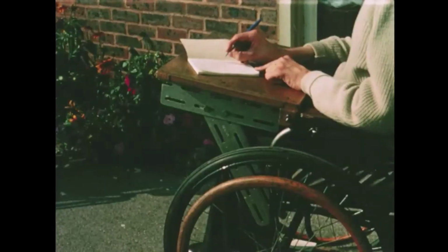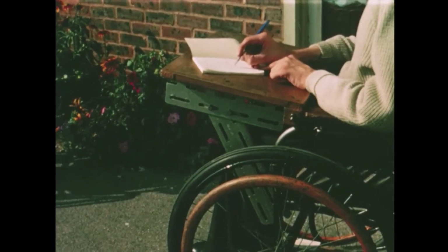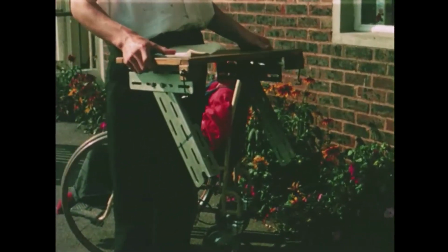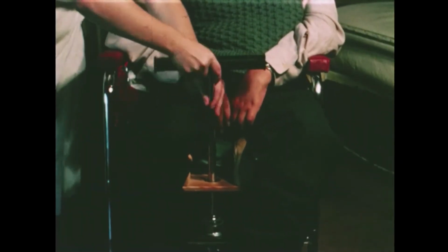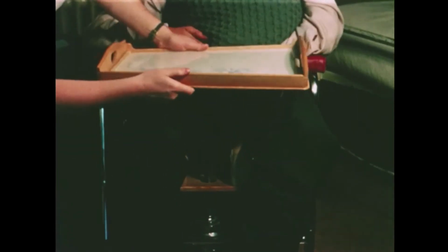This tray is very light and easy for the owner to lift on and off. It's made of Dexion and plywood. A small, wooden tray on a Meccano-like metal frame is easily lifted off a wheelchair. Another sort of tray fits. A wooden tray, with a vertical metal bar attached to its base. The tiller is removed from a monodrive electric chair and the table support substituted. A man sits in a wheelchair while another person attaches the wooden tray in front of him, its vertical bar beneath slotted into a small holder between his legs.